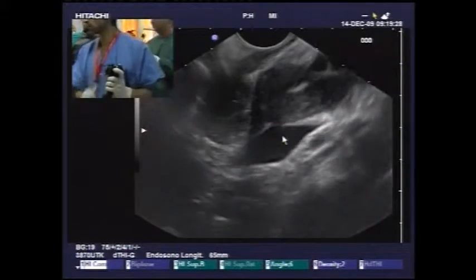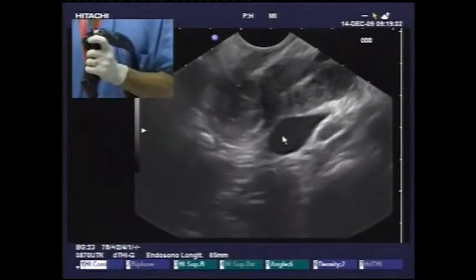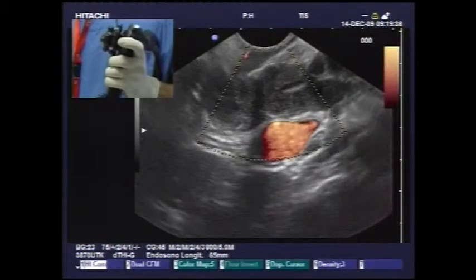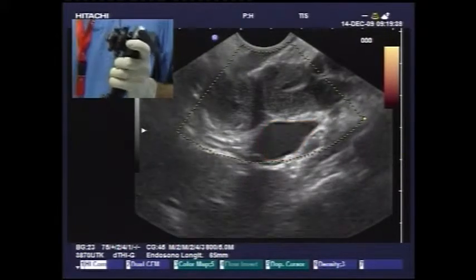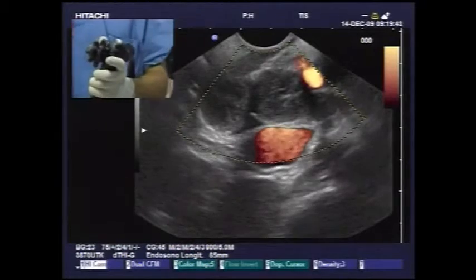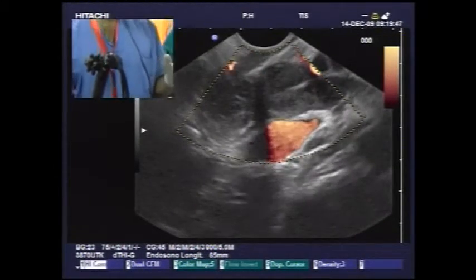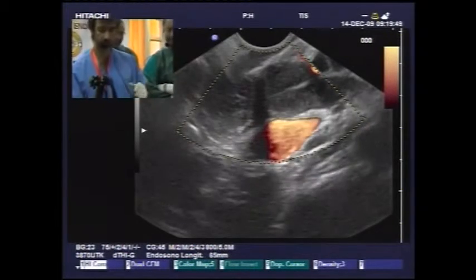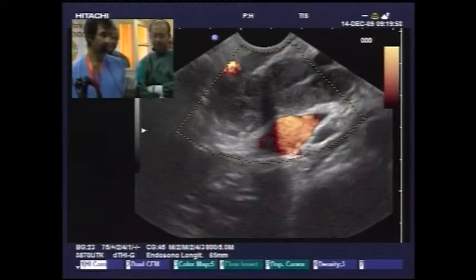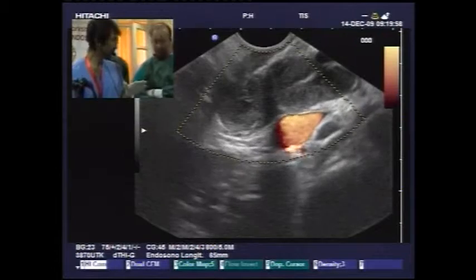Thank you. So here we are in the bulb. I want to avoid the possibility of passing through the food because of the risk of infection. In this case, usually we do not perform any antibiotic prophylaxis to biopsy lymph nodes. We do antibiotic prophylaxis only for cystic lesions and for biopsy in the perirectum.